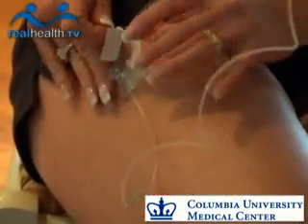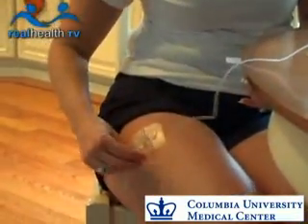And then attached to this pump is a thin tubing, and this then attaches to a little site that, if this were one's skin, just like Laura did it on her stomach or her leg, this is the insulin site into the skin. This particular model is entirely self-contained. This is the insulin, and out of the bottom of this comes that tiny little catheter. So this goes on your body sort of like that, and it's all self-contained, and then you carry around another gizmo that looks like this. So this is on your body. This is by infrared, is what is the electronics and makes it go.